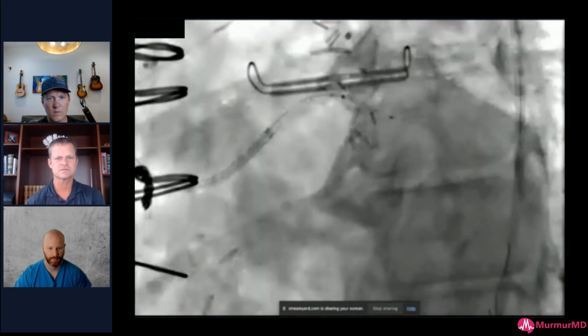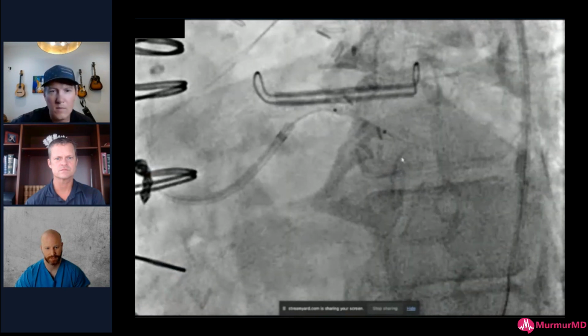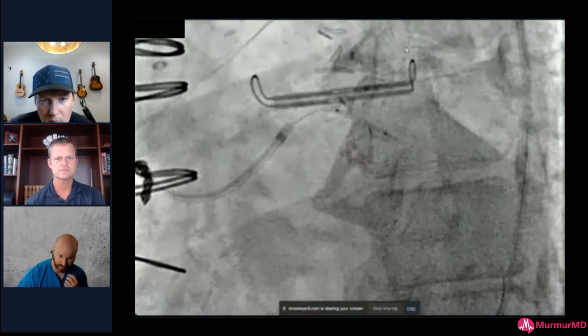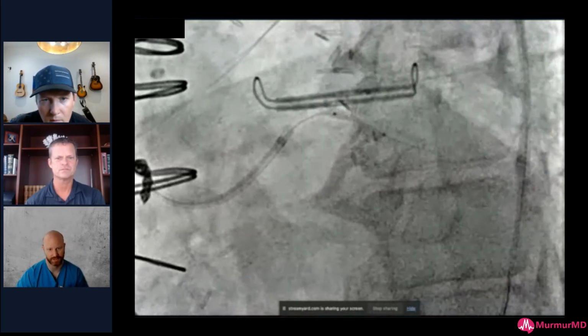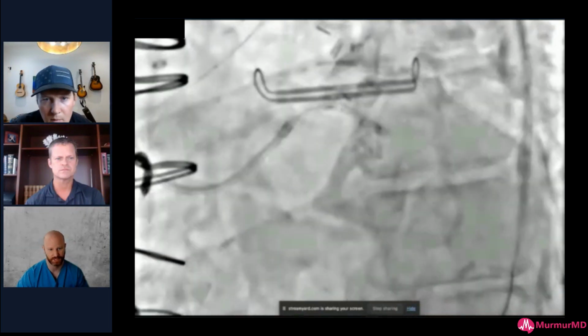It's hard to appreciate, but this is a non-compliant balloon. And then this is my shockwave. You can see how constrained this is. I was a little surprised here. I'll show you the IVUS in a minute. I didn't think it was going to be as constrained as it was, but it turns out that it's also mostly nodular calcium.